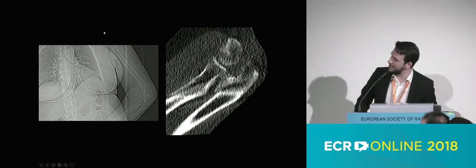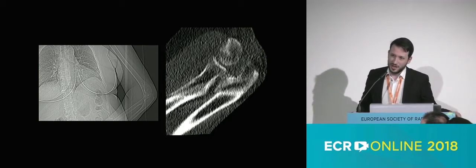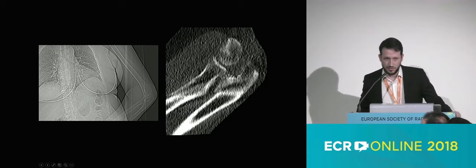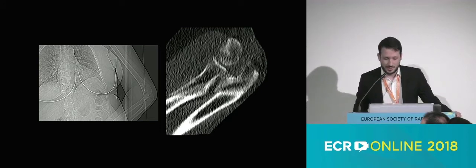She was an 83 year old patient. She had an acute elbow trauma, so obviously, old plus elbow, you think, okay, let's go for MDCT. And no, it wasn't a good idea. Even if we have a pretty good MDCT, you clearly can't see anything. Why? Because I remind you that if you want good image quality for the elbow, you have to lift the elbow at least above the shoulder to limit body artifacts, and this was not possible in that case.